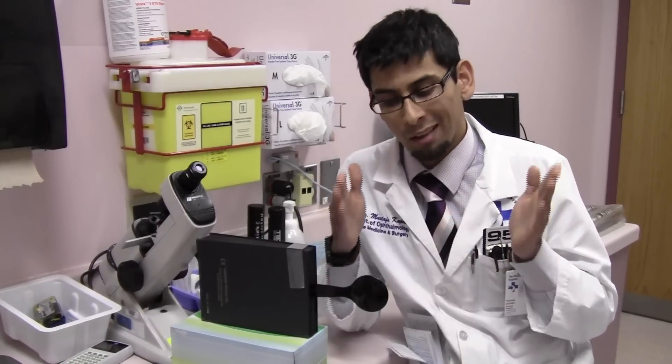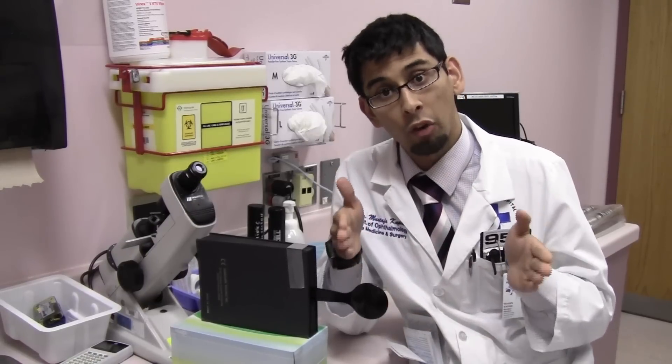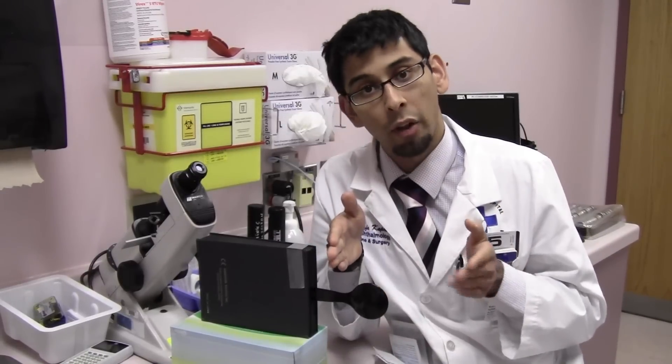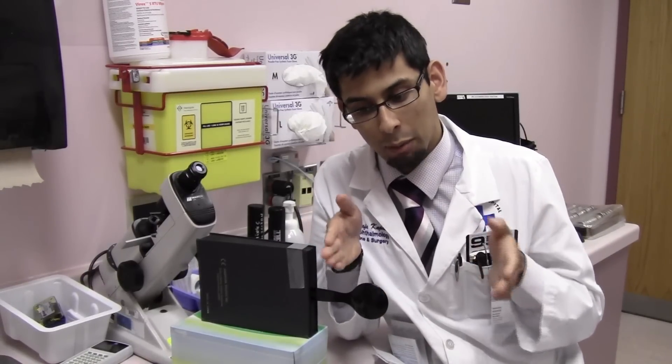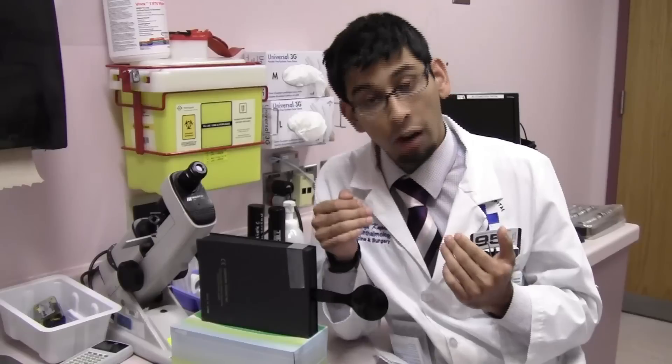What about phoria? Phoria means that the eyes are in alignment most of the time. There is a mechanism in the brain called fusion that holds the eyes together. When the brain receives a stereo image, it's able to force the muscles to fuse the images to keep the eyes in alignment. You need to do the alternate cover test to break fusion, meaning the brain is only going to get an image from one eye at a time, so it won't be able to use stereo information to hold fusion. You're going to break down fusion and get a deviation. This is a phoria by definition — not a tropia. It's latent, not manifest.